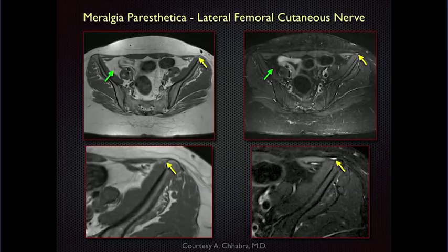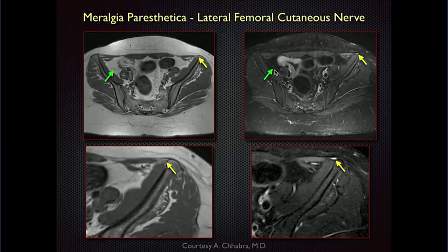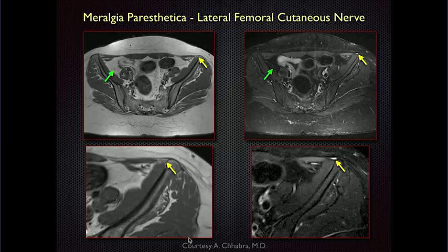Here's an example of an abnormal nerve but very subtle. On the right side there's a little tiny nerve with barely perceptible signal intensity — you'd barely notice it. On the left side, right adjacent to the anterior aspect of the iliac crest, there's a really bright focus. That's a lateral femoral cutaneous nerve that's hyperintense because it's irritated. This is an example from colleague Avnish Chhabra showing meralgia paresthetica. You would really need to know that clinical information and know where to look to even see this abnormality — otherwise you're likely to gloss over it entirely.